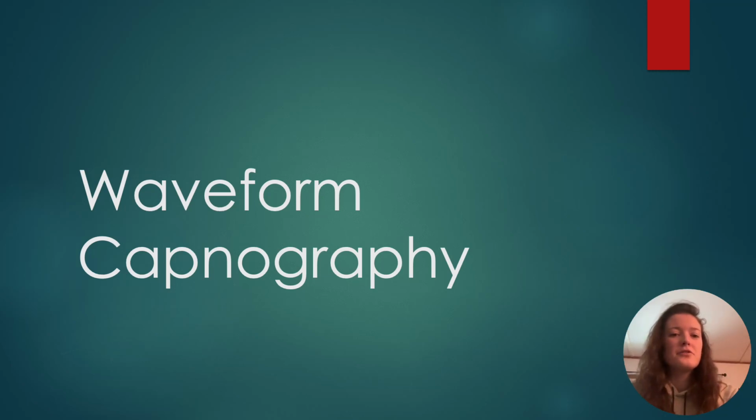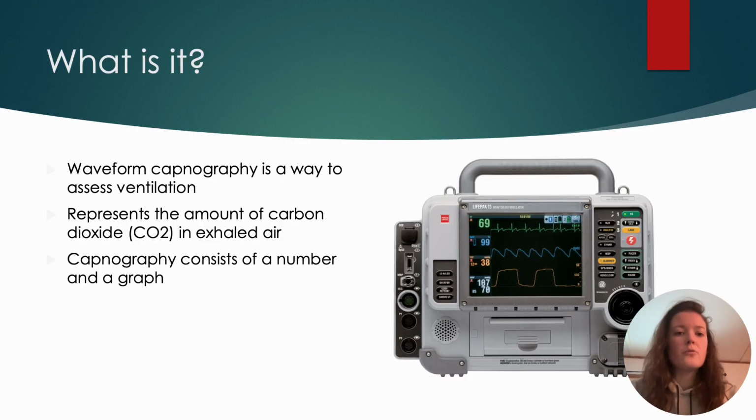Today I'm going to talk to you guys about waveform capnography and how it can be used to assess how well a patient is ventilating or breathing, and how it is able to show you different things when it comes to treatment. So first of all, what is it?